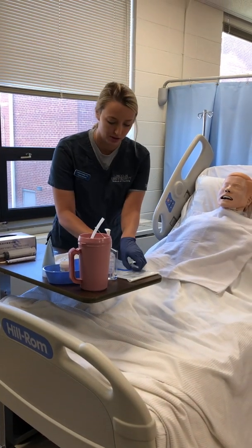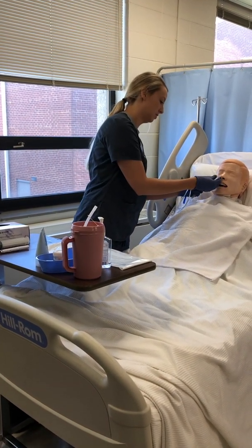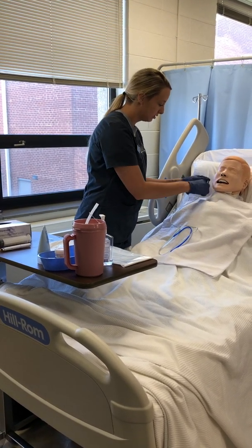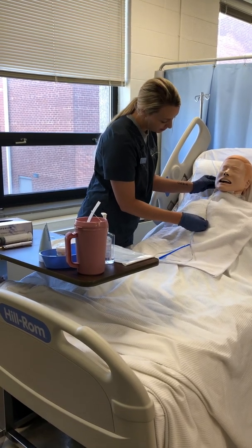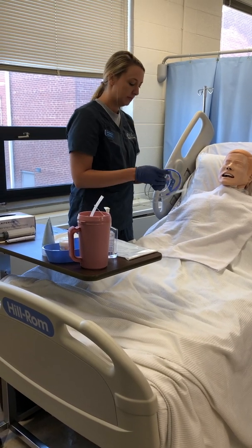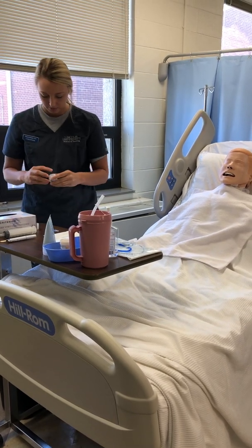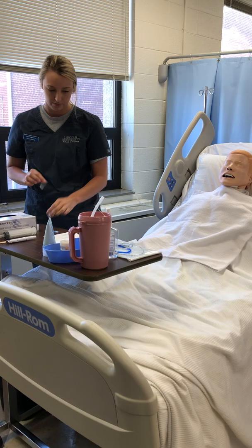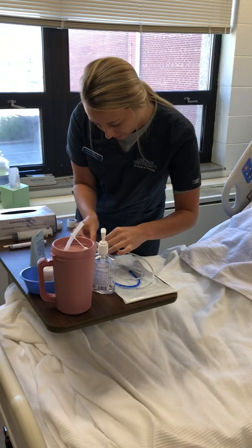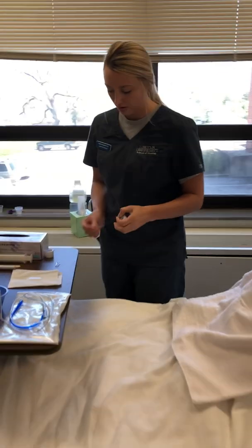And then I would measure my tubing from the tip of the nose to the earlobe, and then from the earlobe to the xiphoid process, which is about 45, and then I would put a piece of tape there. Mark it on the 45. And then also make some tape for later.